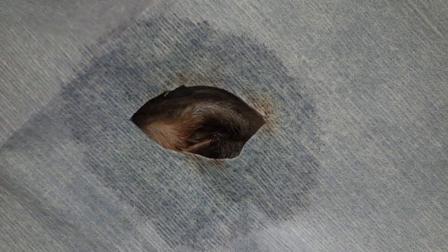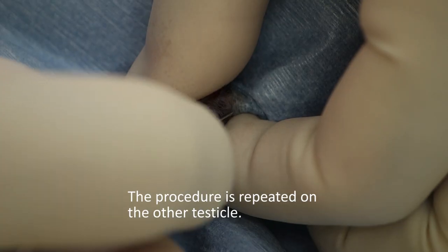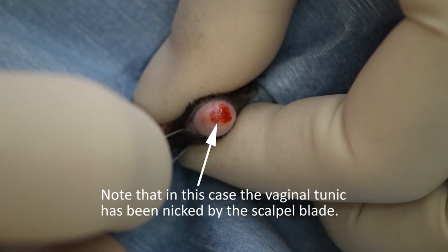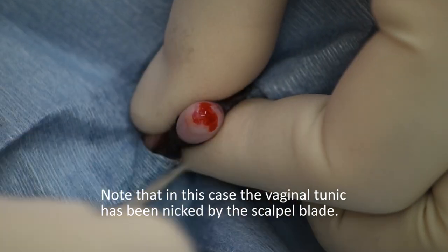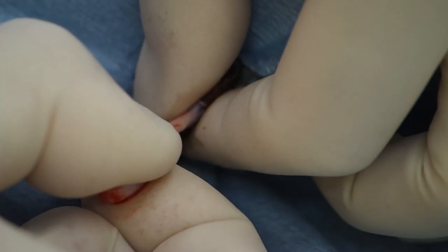We now repeat this procedure on the other testicle. In this case, we go a little bit too deep and just nick the underlying vaginal tunic. If we were performing an open castration, then we would go right through into the vaginal tunic.